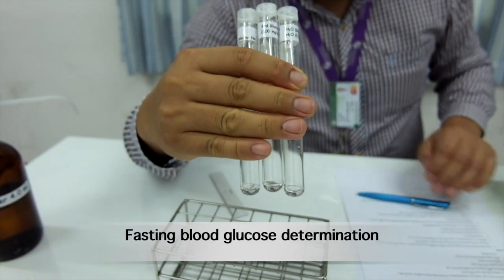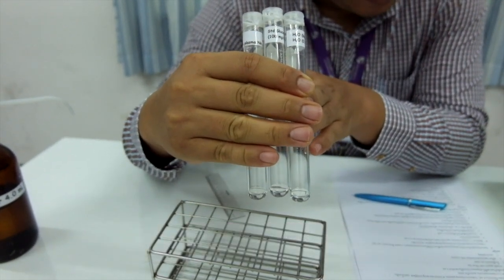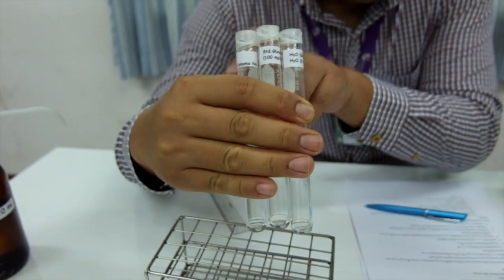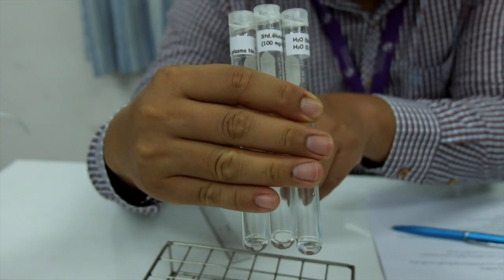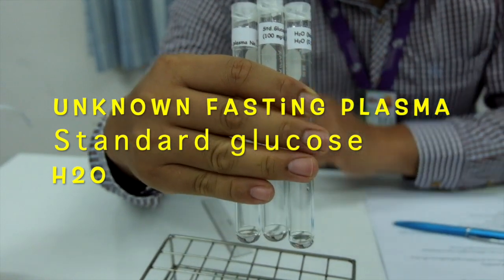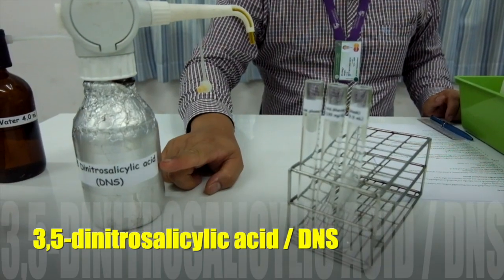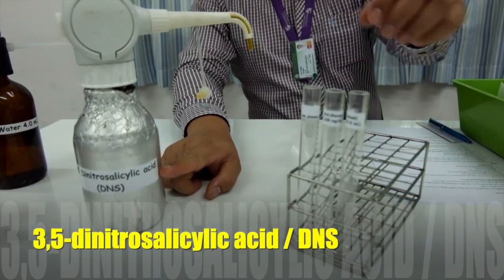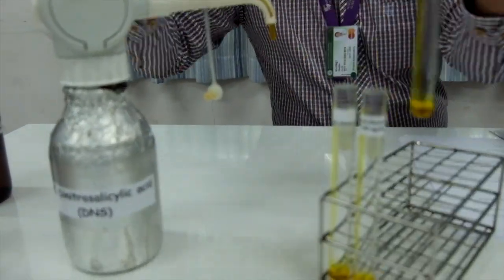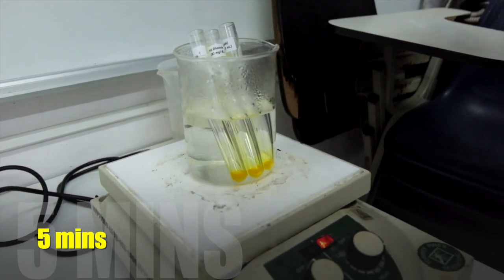We shall start with the determination of fasting blood glucose. To determine fasting blood glucose, you receive 3 test tubes containing 0.5 ml of unknown fasting blood plasma, standard glucose, and distilled water. Add 0.5 ml of 3,5-dinitrosalicylic acid, or DNS, into all test tubes. Mix well on palm. Boil all tubes for 5 minutes.